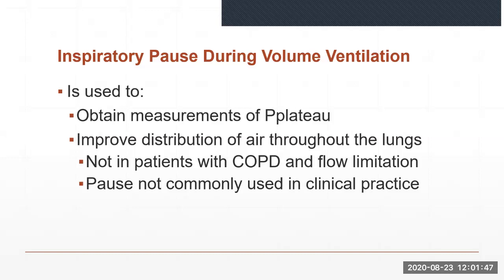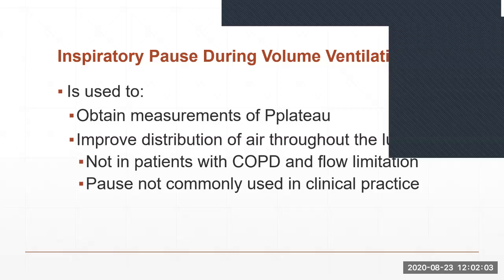This maneuver must be used with care or not at all in patients with COPD and flow limitation. Inspiratory pause with each breath is not commonly used in clinical practice because it may significantly increase mean airway pressure and reduce pulmonary blood flow.